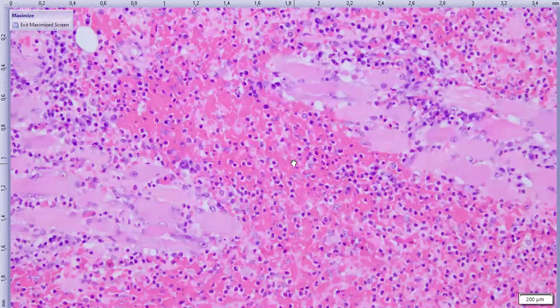The other thought for a really eosinophilic rich infiltrate in tissues like this, there is something called hypereosinophilic syndrome, which is basically where you have an apparently non-neoplastic population of eosinophils in the peripheral blood and sometimes infiltrating organs. And then eosinophilic leukemia is also a possibility, which is essentially a neoplastic population where a lot of eosinophils are being produced. In the latter case, you would tend to get some sort of other blood work abnormalities, though, like anemia, basically a signal that the bone marrow is being eaten up by these abnormal cells, which we didn't necessarily have in this patient. So basically just some thoughts on this really unusual presentation of really severe eosinophilic infiltrate.